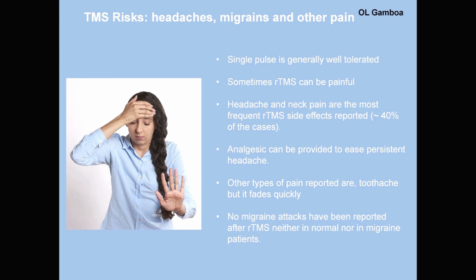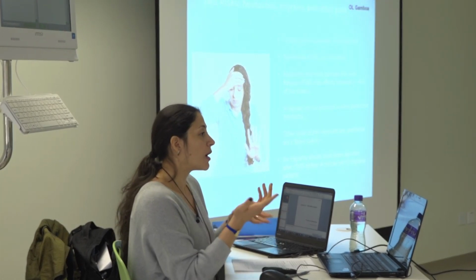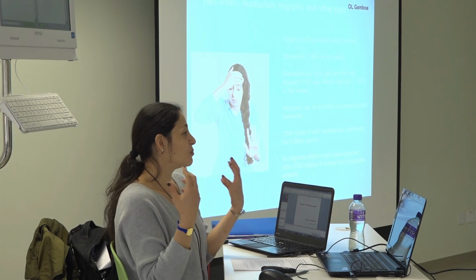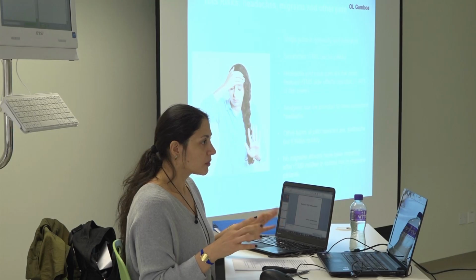When people have headaches, like I said, it has not been my case, but maybe other people have had this situation. You can provide just an Advil or an analgesic for the pain, and it will pass. It's not permanent. It could be for many reasons. Some people are more susceptible to believe something will happen, and then they have the impression that something happened, but it didn't. I did have this experience, and they just take one pill and that's it.